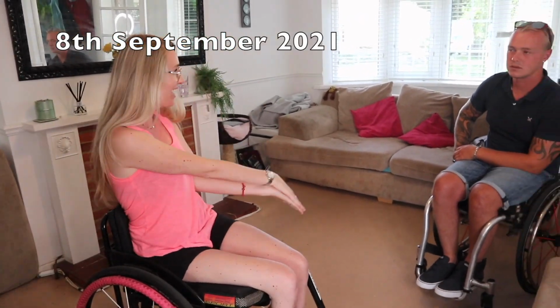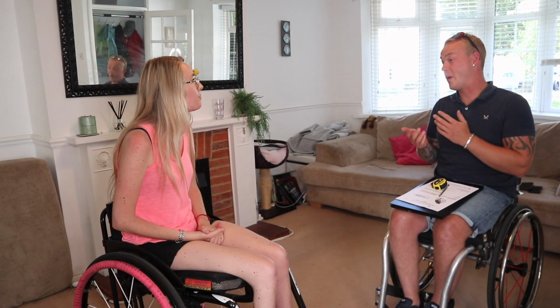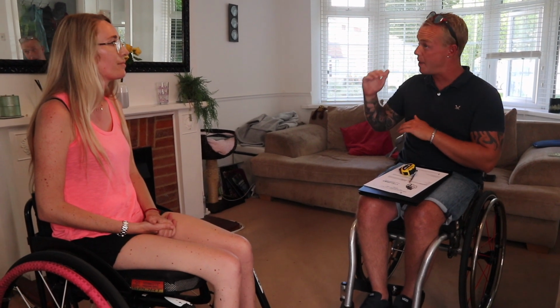Spencer is here. Hello. Okay, Spencer's going to share just a few top tips. Knowing your level of injury, and that's for one, backrest height. So obviously, depending on the level of your injury, we would always recommend a higher backrest for a higher injury and a lower backrest for a lower one.